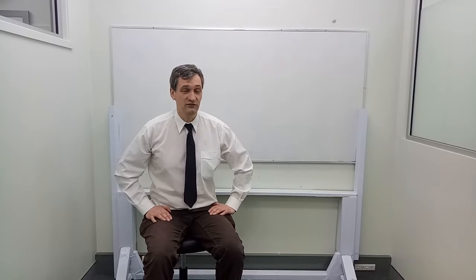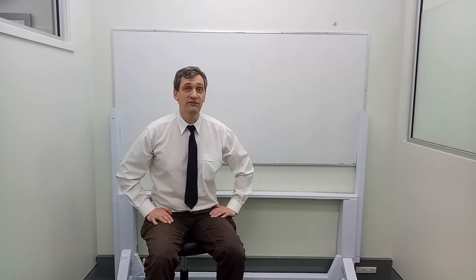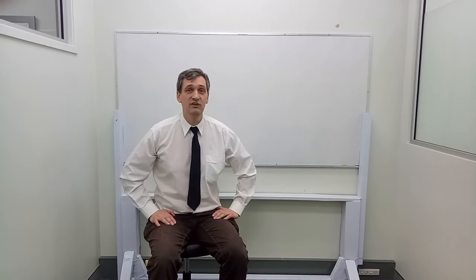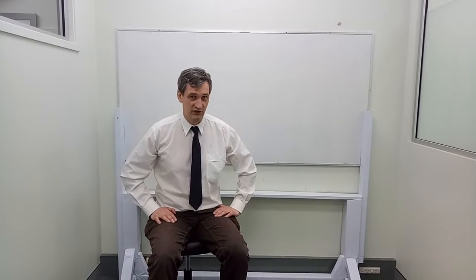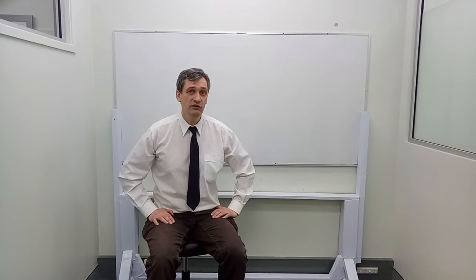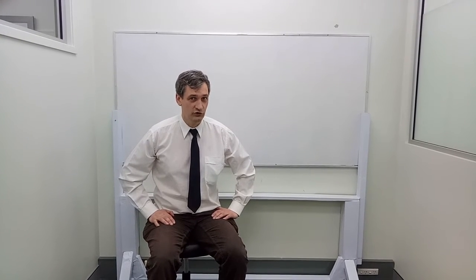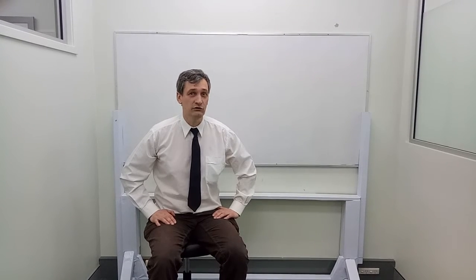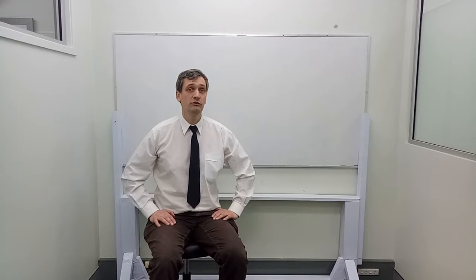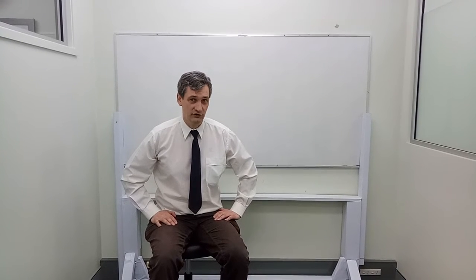You may also face more difficult fractures. They may be quite displaced. They may be malrotated. In these cases, you're going to need to adjust the vectors. If it's a malrotated fracture, if you're moving the finger in towards the scaphoid tubercle, you're going to create a correctional torsional force. That will be helpful to correct and reduce the fracture.